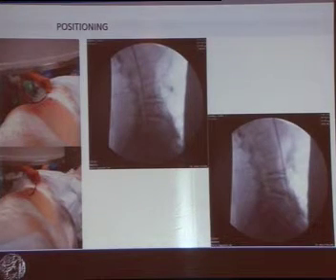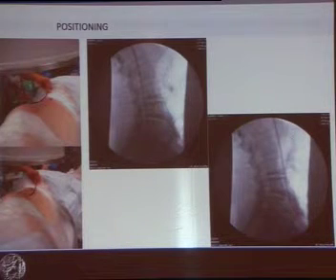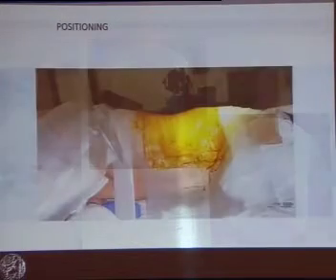At this point, I need to emphasize that in case of inadequate patient placement on the operating table, the cage can be easily inserted in a wrong anterior to posterior direction, or in the worst scenario, an iatrogenic injury to the lumbar plexus, the large abdominal vessels, or even the viscera may occur during dissection.